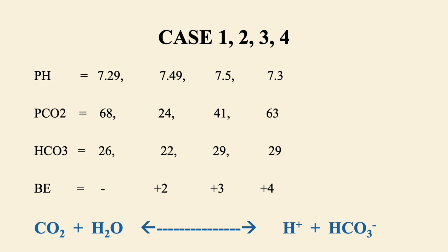In this case, this patient has 22. Your bicarb, of what it's supposed to be, it is more than that. So there is additional metabolic alkalosis in this patient. Okay? So this is how you do your respiratory cases.